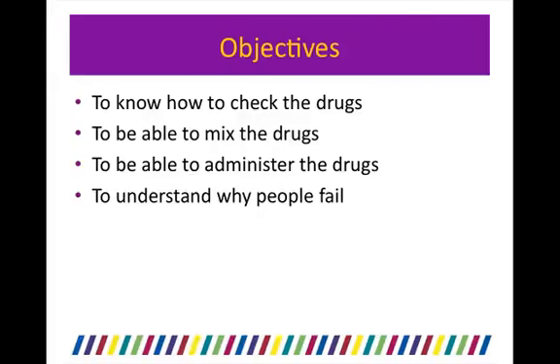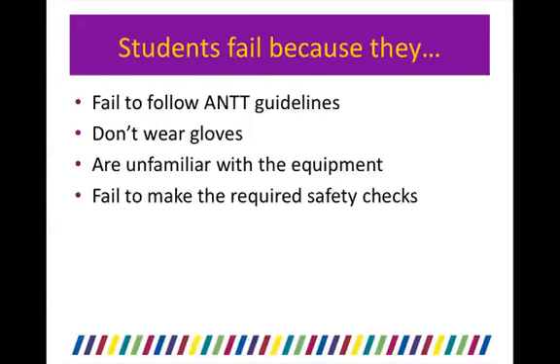There are a couple of different ways to administer an antibiotic. One is via an IV push. That's giving the antibiotic by an injection over approximately 5 minutes. The other is by an IV infusion. That's using a drip to give it over approximately 1 hour.